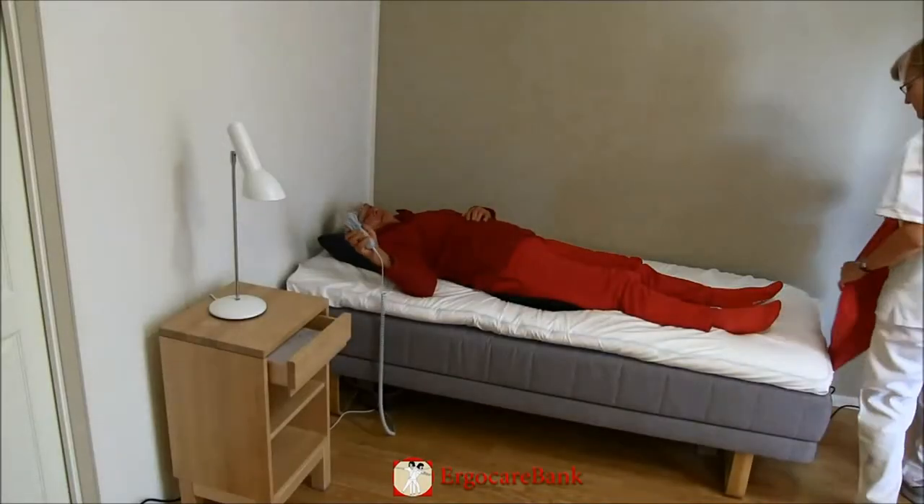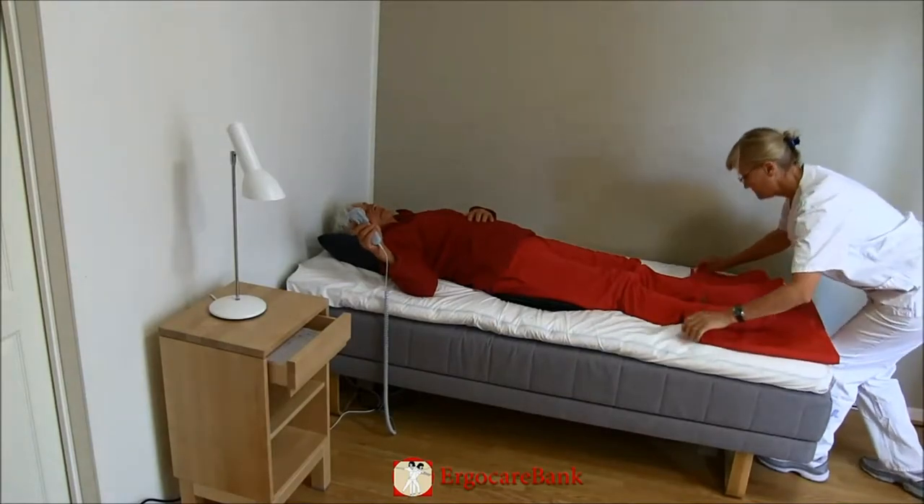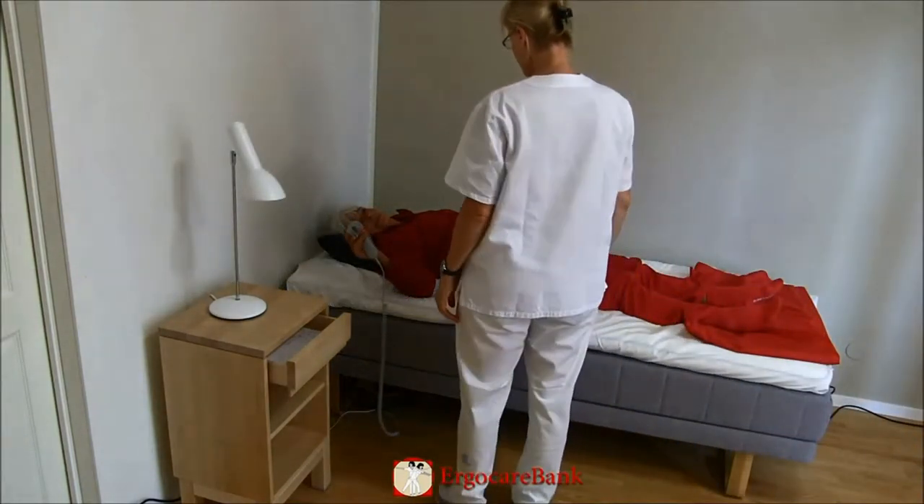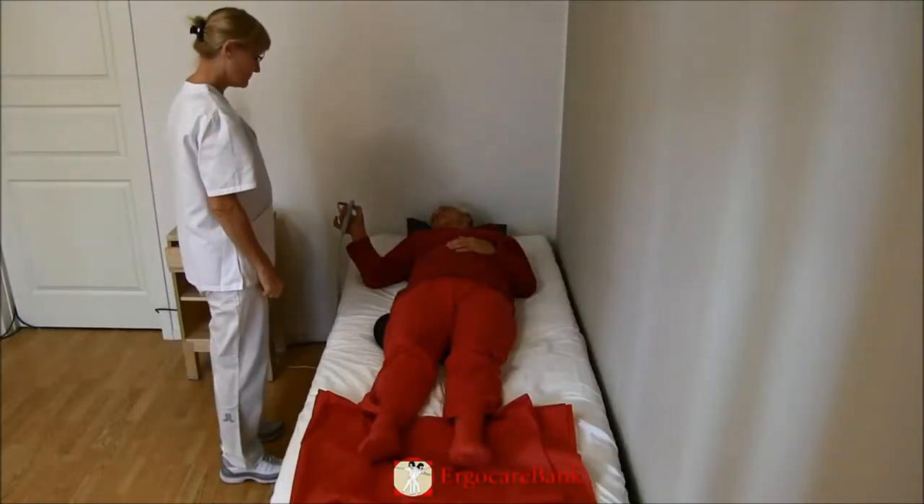Celia can use the control for raising the head of the bed herself. The staff member puts a folded sliding sheet under Celia's feet to make it easier for her to slide her feet off.